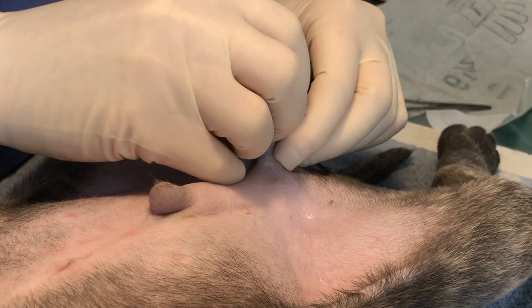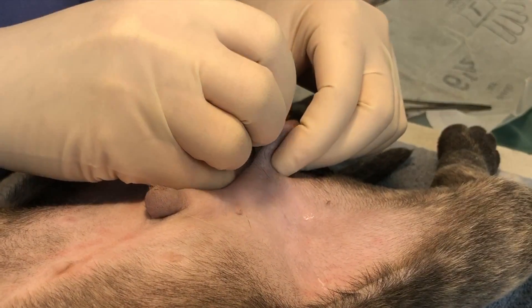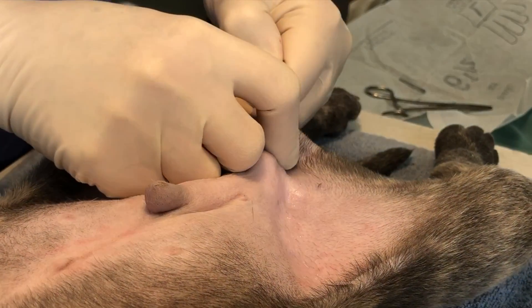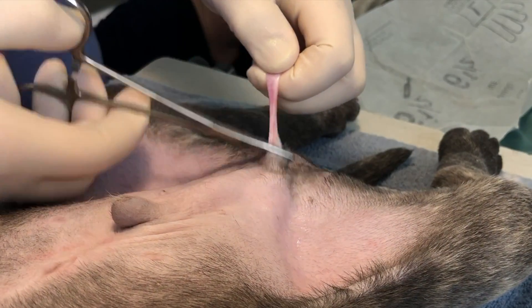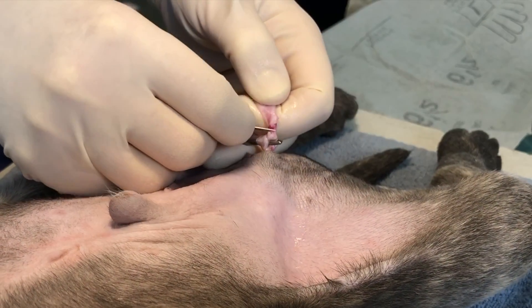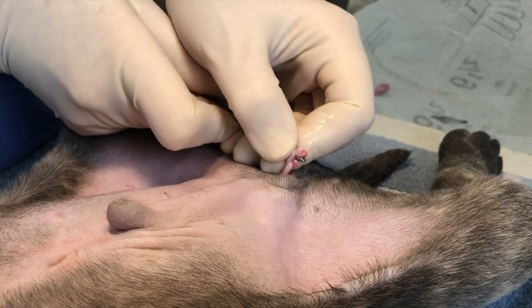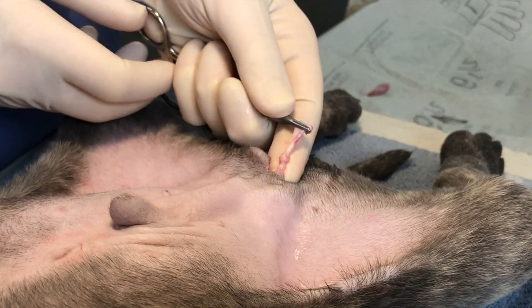The first testicle is held between the thumb and fingers as an incision is made on the midline of the scrotum. With manual pressure, the testicle is exteriorized and fat is stripped away from the cord. A closed castration is performed by auto ligating the cord using a hemostat. Once the knot is formed, a blade is used to cut between the hemostat and the testicle, removing the testicle and allowing for the knot to be completed. The knot is secured and inspected and released into the abdomen.